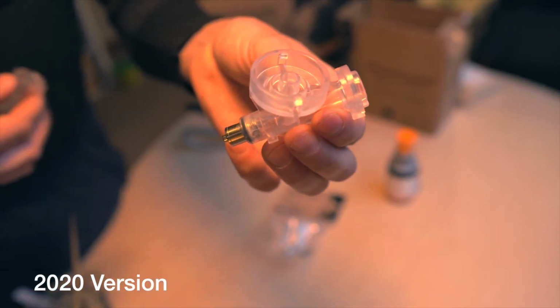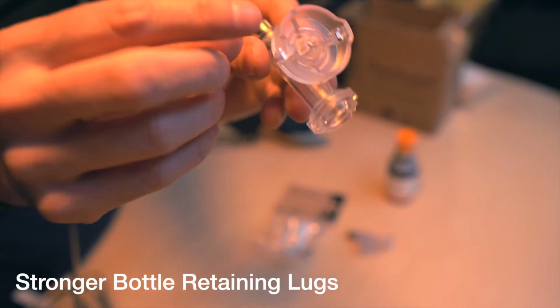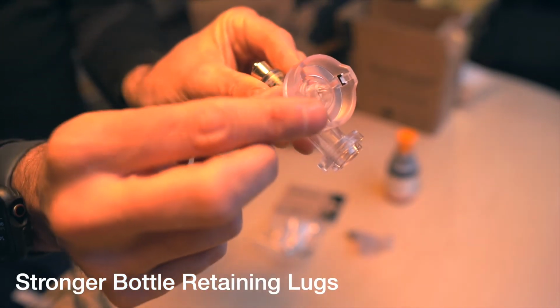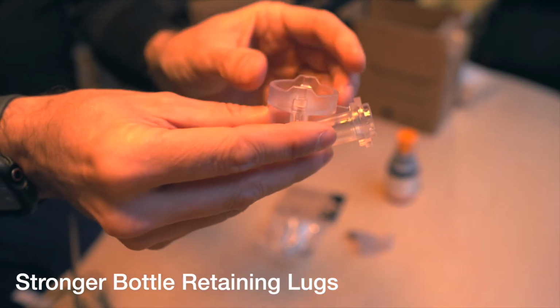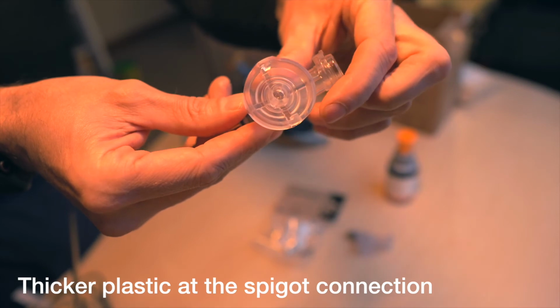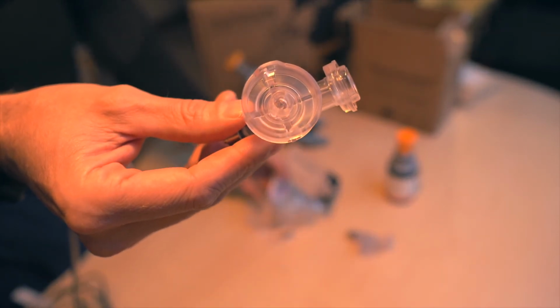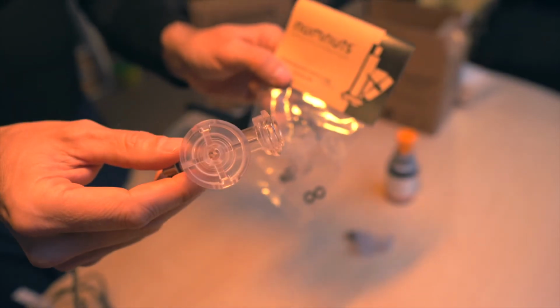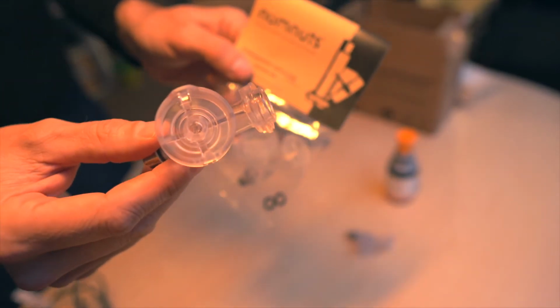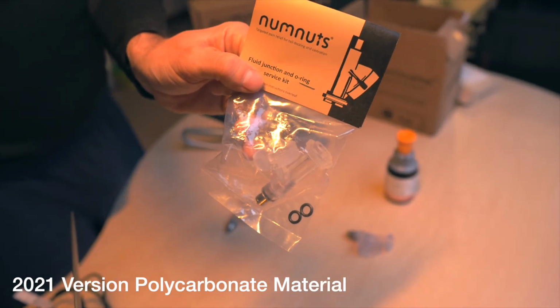So in 2020 we improved that. We listened to the feedback, and the improvements were to change and thicken up these lugs here, which holds the product on much more firmly, and we also thickened up the inside. In 2021, improving on that again, we actually changed the material from an ABS material to a tougher polycarbonate, and this is a new polycarbonate version.